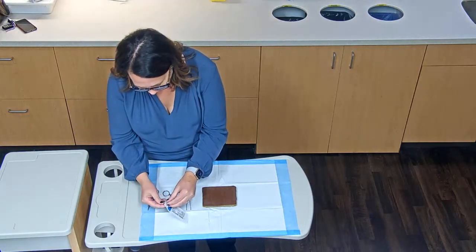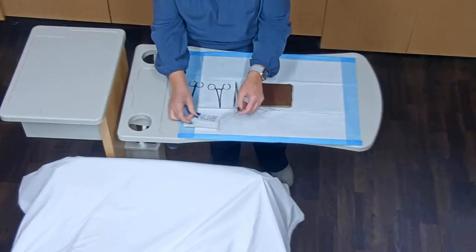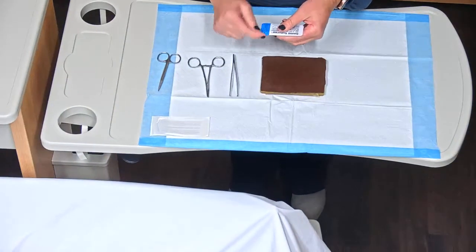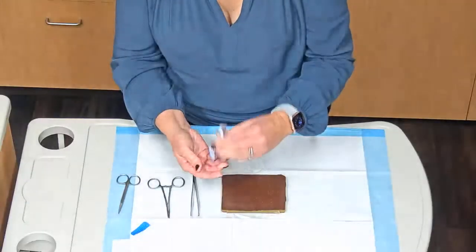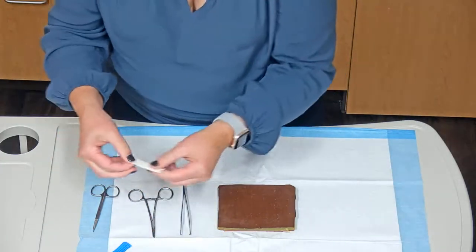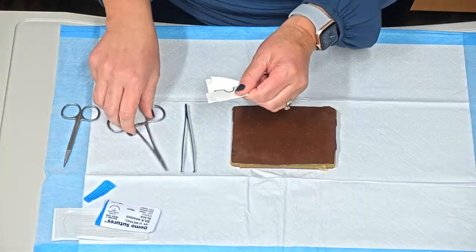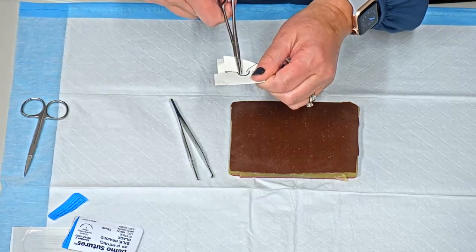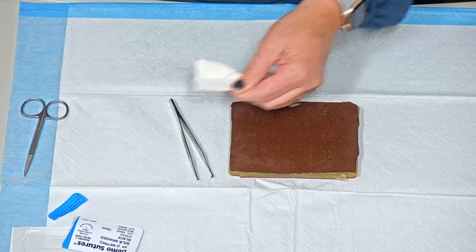So what I'll have you do is go ahead and open up your demo sutures. I know this seems silly, but even at the top, you want to make sure you open them the right way. There's a little notch in the blue area. When you open them, they should come out, and they are contained so that your needle is at the top and it's protected. So when you open your suture, you want to kind of go 2/3 back. You'll go ahead and pull out your thread.